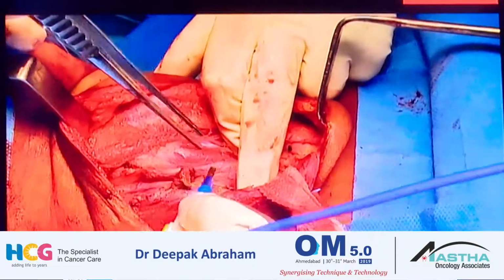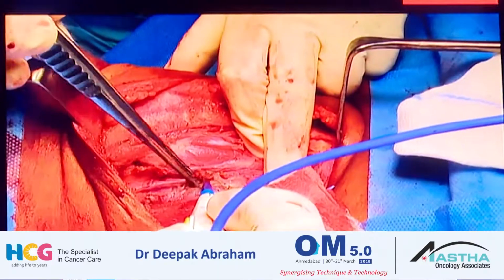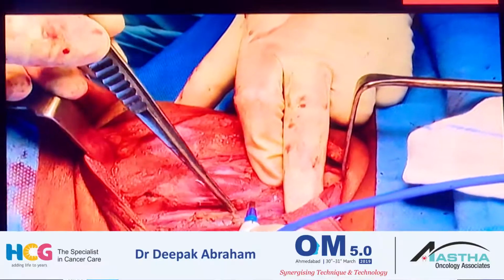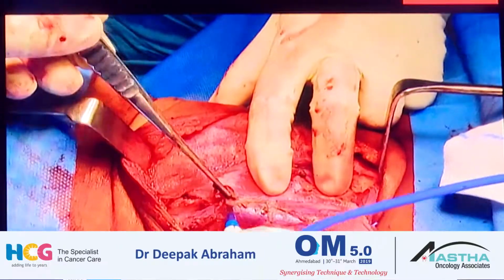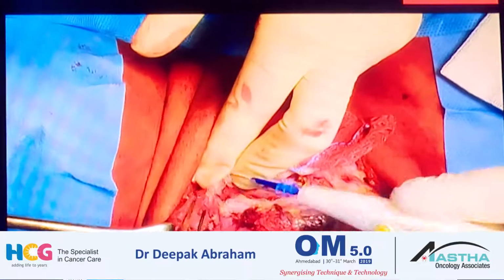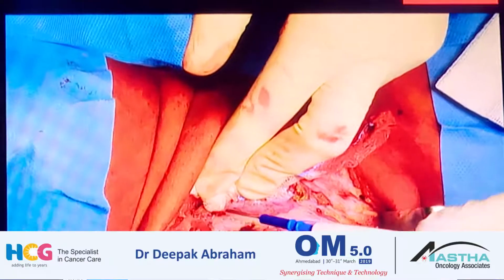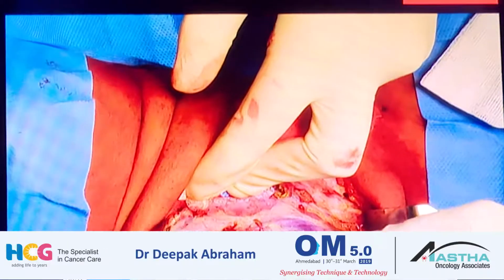And to go to the lateral neck, we use the lateral approach, and the nodes medial to the IJV are dissected off and sent separately, which includes level 2A. And so we go up on the IJV as shown here, and that's level 2A, and this is the head end of the patient, that's the foot end of the patient. And so these nodes are sent separately.